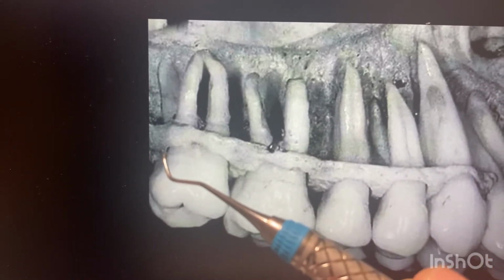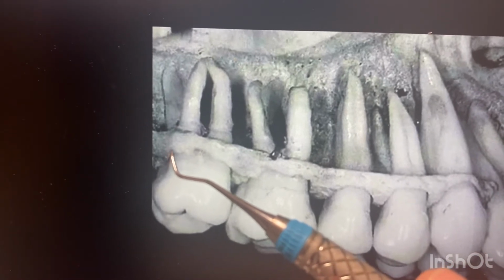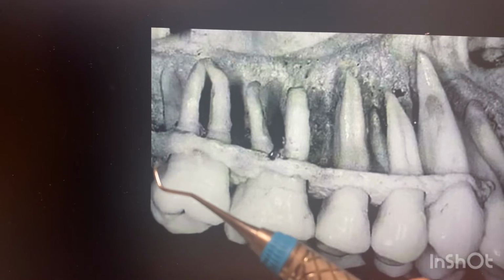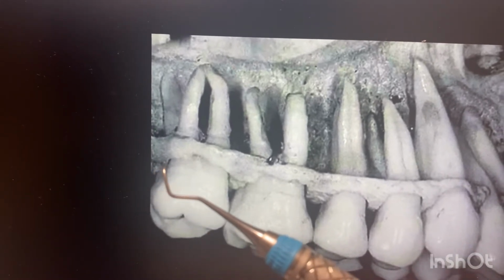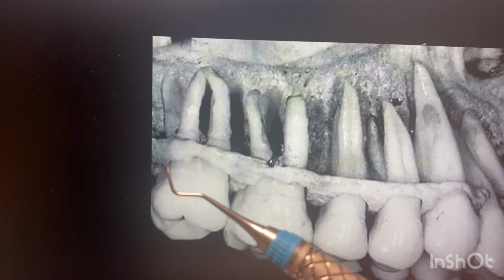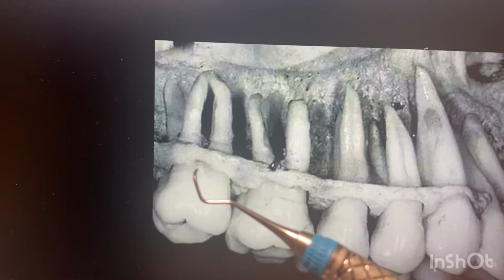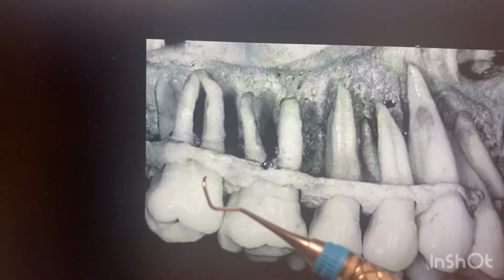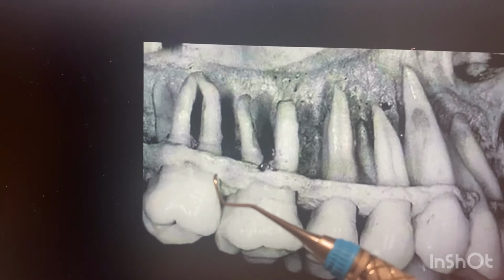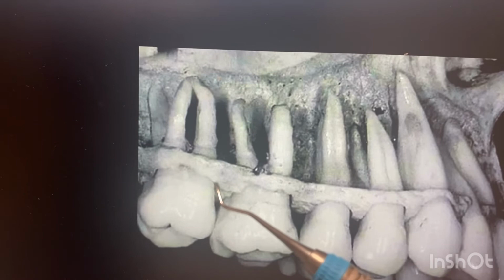Once open, you're going to begin overlapping strokes on the distal area of the tooth. You're going to come back to the distal line angle and roll your instrument and begin oblique strokes on the buccal area of the tooth. Once you approach the mesial area, you're going to roll your instrument again and enter mesially.